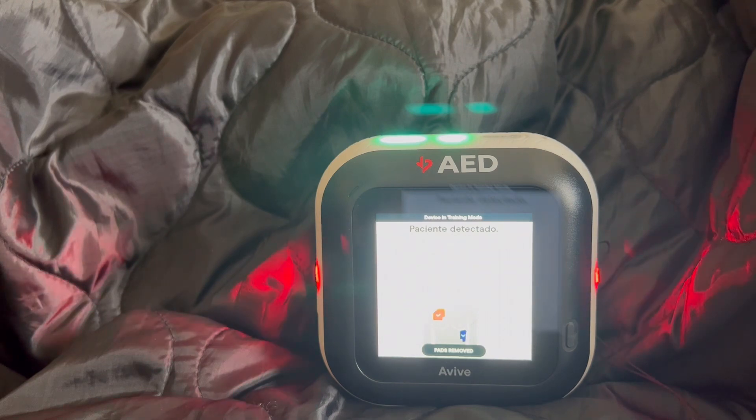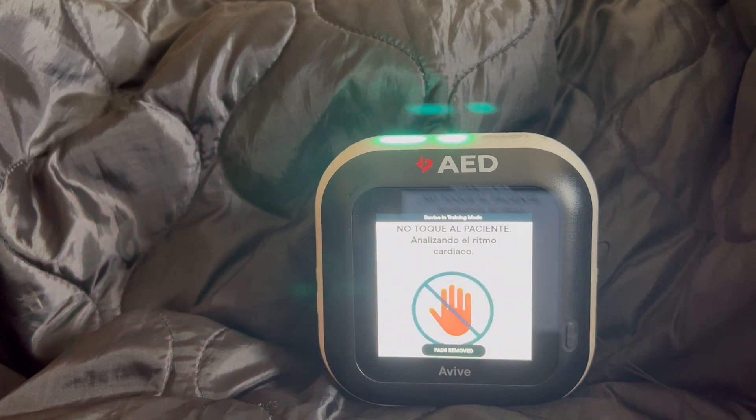Paciente detectado. No toque al paciente ni los parches. Analizando el ritmo cardíaco. Descarga sugerida. Aléjese del paciente ahora. Retírese, entregando descarga eléctrica en 3, 2, 1. Descarga entregada.